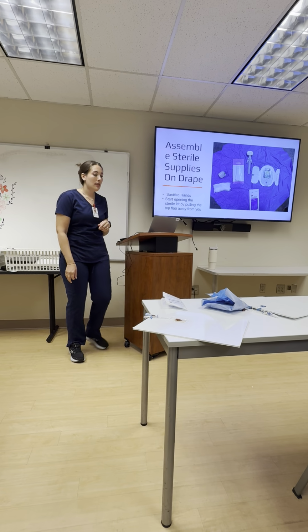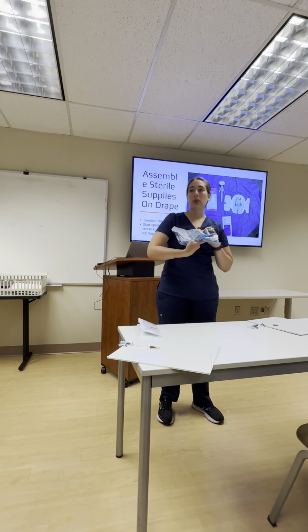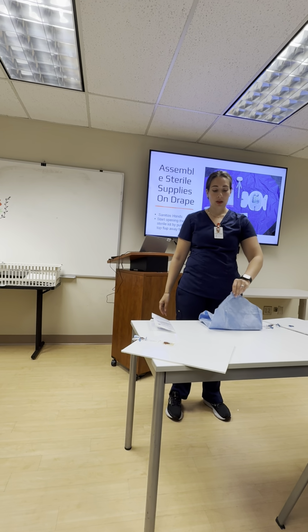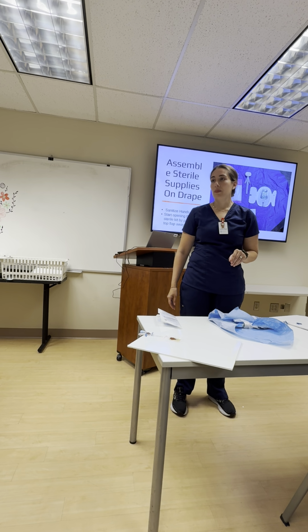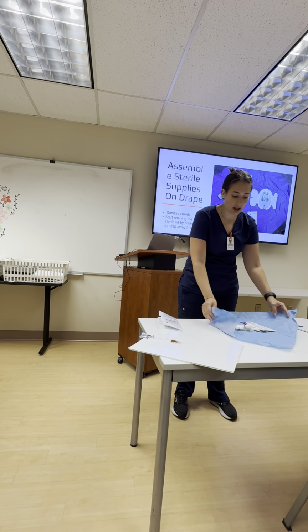Okay, next we're going to assemble our sterile field. So when you're taking the package, anything inside here is sterile. We want to take the top flap and push it out away from ourselves when we're opening it. And then we open the sides and the last part.